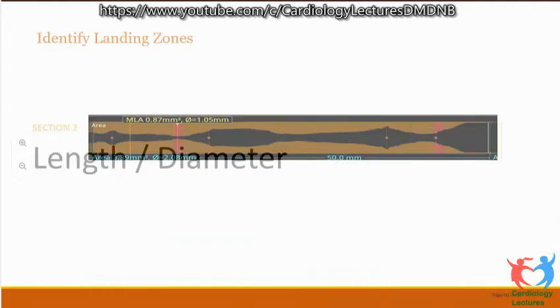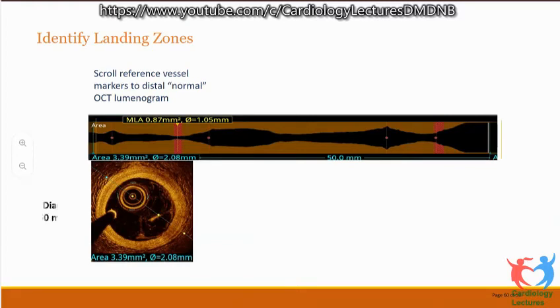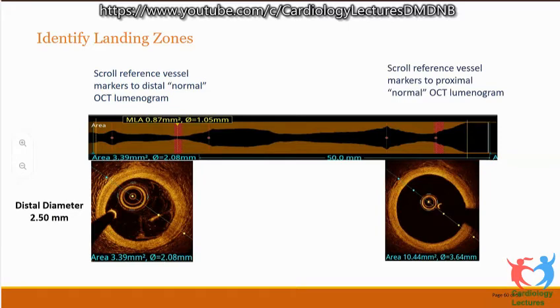So based on our OCT images, we did the proximal and distal referencing. The distal diameter came as 2.5 and the proximal reference diameter came to around 3.5. So there was a lot of taper in this vessel and the lesion length was around 50 millimeters. When you get a lesion like this, which is pretty long, it dictates that you use two stents. Even if it were, say, 25 millimeter, with distal diameter 2.5 and proximal 3.5, I would have used two stents because I cannot dilate a 2.5 stent to 3.5 millimeter. The size matrix does not allow this.